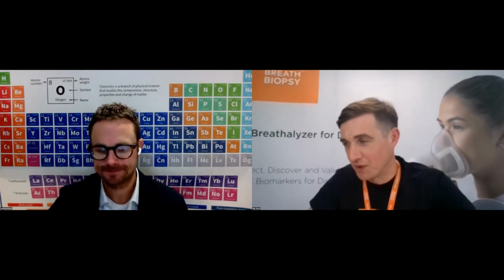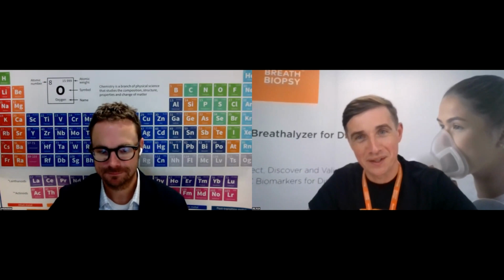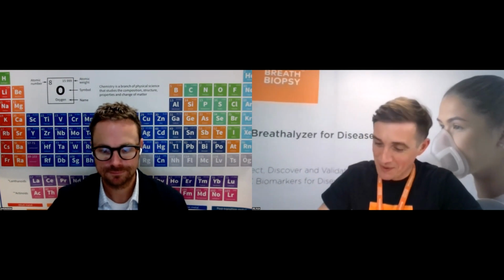And actually, one of the interesting examples that was brought up to us was methane, which is definitively on breath. One of the very few breath tests that's actually available on the market, but actually not everyone is a methane producer. So if you were to class methane as being on breath and must be present in greater than 50% of the population, it wouldn't be classed as on breath a lot of the time.